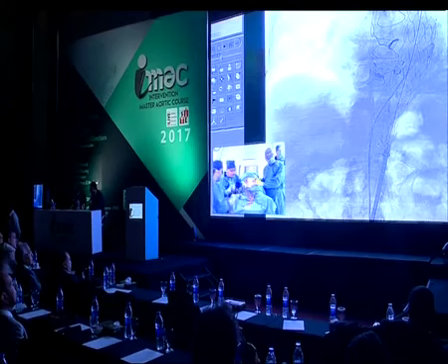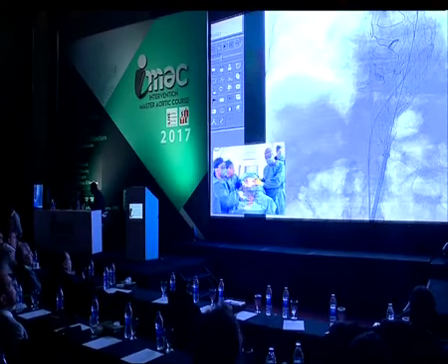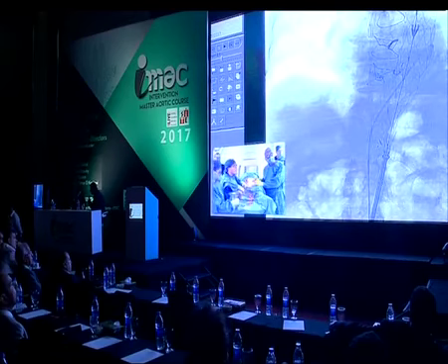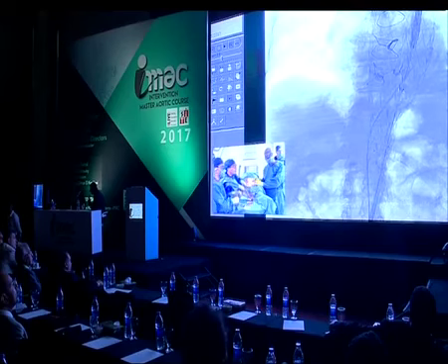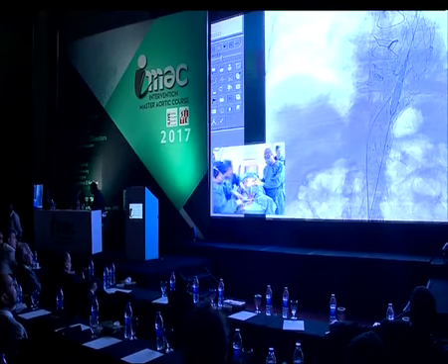Okay, we can see that the deployment of the body is completed, and the top end is also deployed. Yeah, that looks very good.